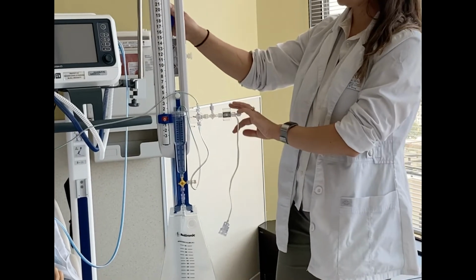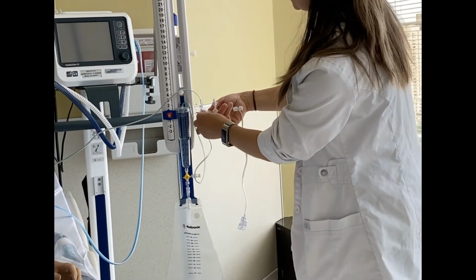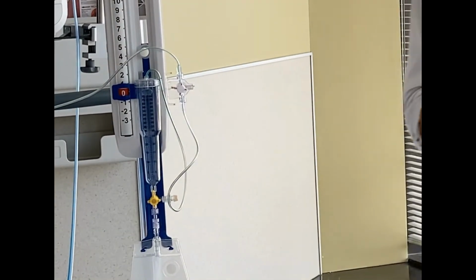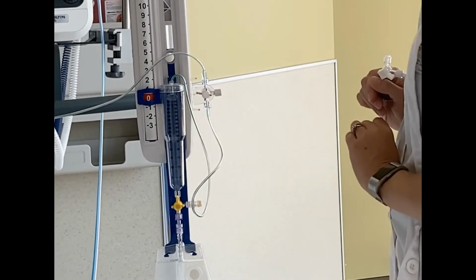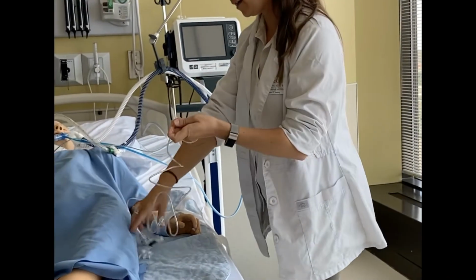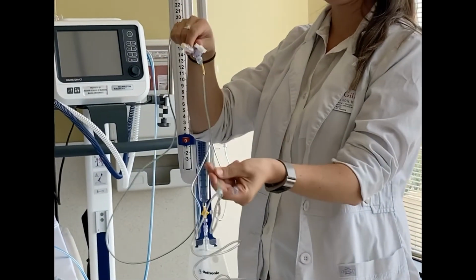Now, this is just one way to configure your system for ICP monitoring. Another way to do this is, again, I would be sterile when I'm setting up my system. I would not connect my transducer here, but instead I would just keep my sterile, non-vented cap here. I will take extra pressure tubing that comes in a sterile package, and I can connect the pressure tubing directly to where my ventricular drain sits.